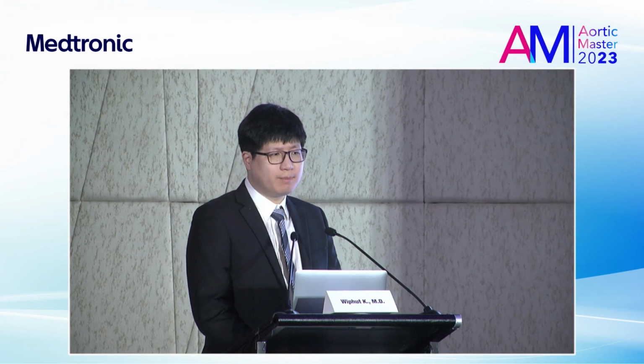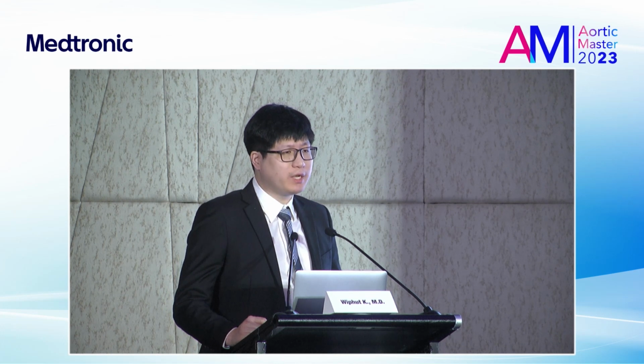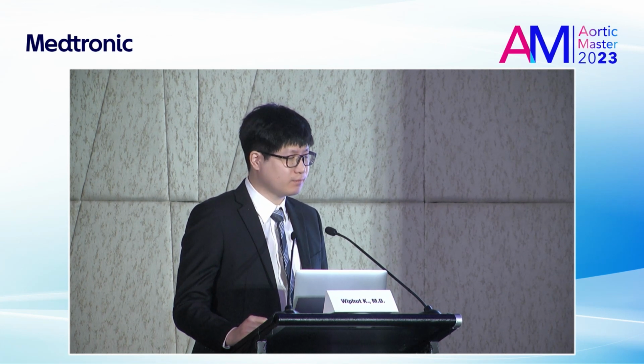So far, we oversize the stent graft around 20 to 30% relative to the Dacron graft, and so far we have no problem with that oversize. So that's something I don't know. What's the panel's view?